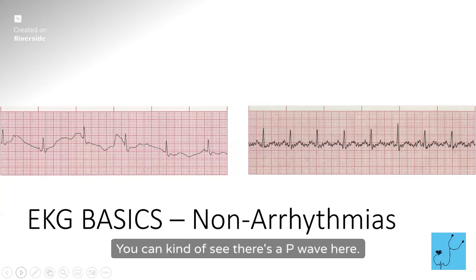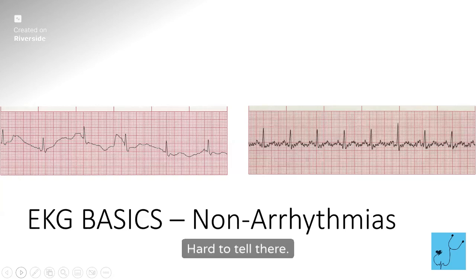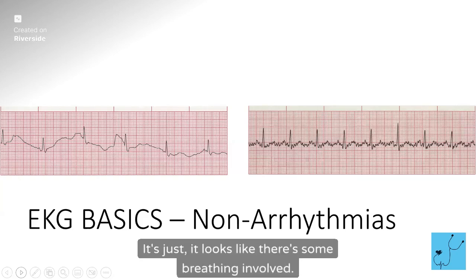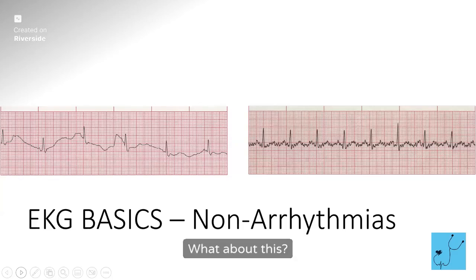You can kind of see there's a P wave here. Hard to tell there. There's a P wave here, a P wave here. They all kind of look the same. It's probably sinus rhythm. These look pretty narrow. So it's not like it looks like they have a bad underlying rhythm. It just looks like there's some breathing involvement. What about this? What is this stuff? And do we care about it?